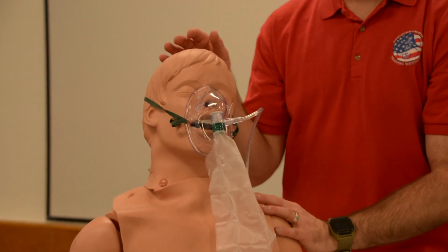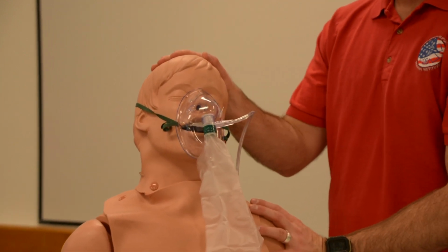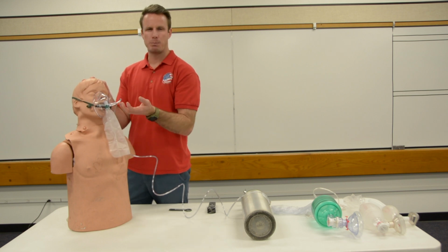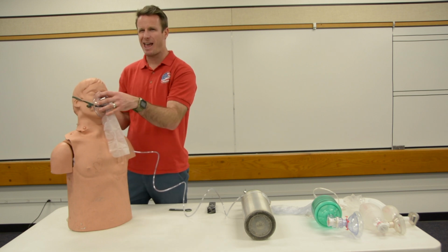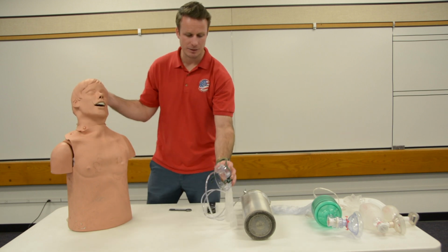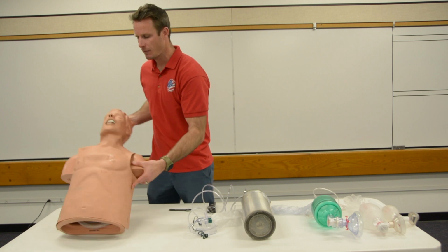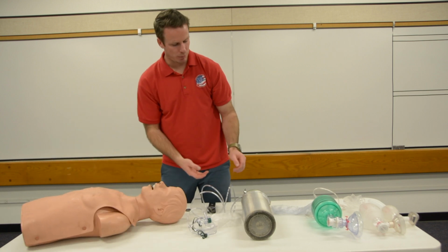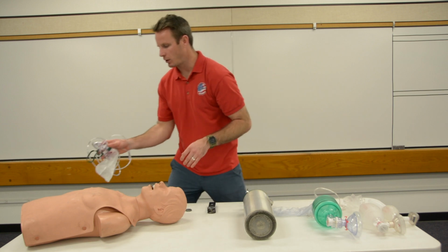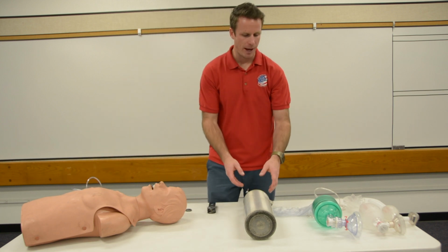Now again, maybe my patient is having respiratory problems, but my patient's not breathing very well on their own. Just spraying oxygen in their face isn't really going to help that patient very much. So we might want to use a different type of device to deliver that oxygen. In that situation, where your patient's not breathing very well, we need to actually use what we call a BVM, or bag valve mask.